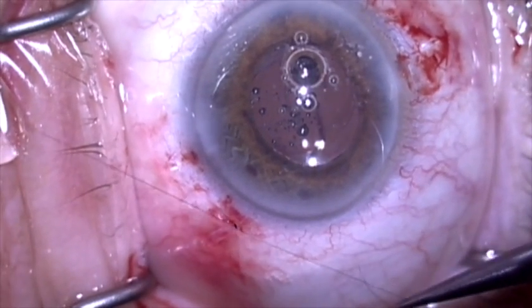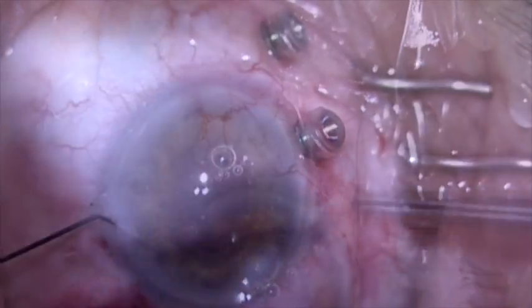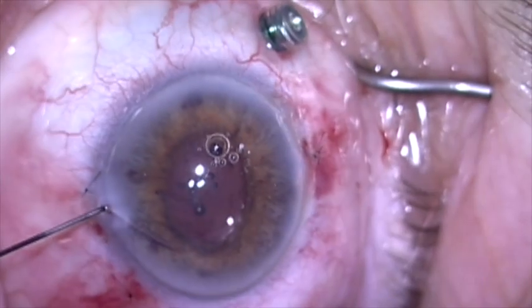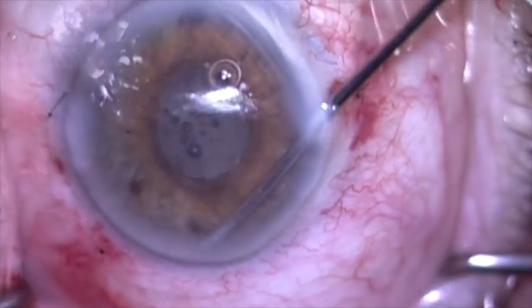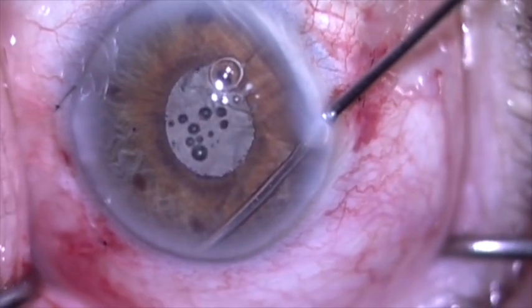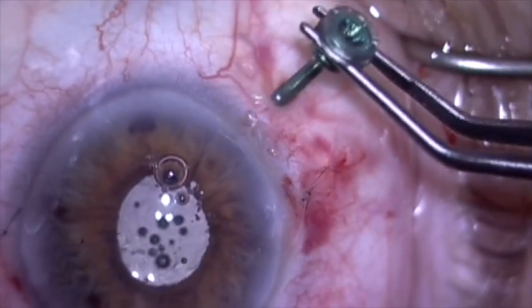Conjunctiva is now closed on each side with a 10-0 nylon suture. We'll place some Miochol in the anterior chamber to bring the pupil down, and then after the pupil is constricted I'm going to do a peripheral iridotomy with a vitrector to reduce the risk of postoperative reverse pupillary block. The paracentesis is closed and the case is completed.